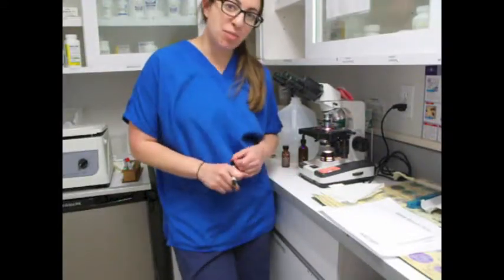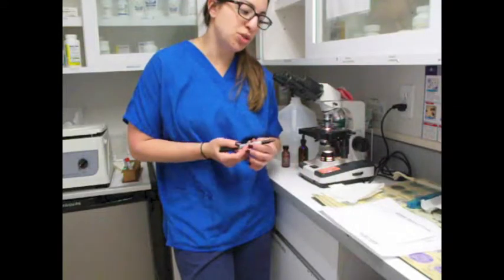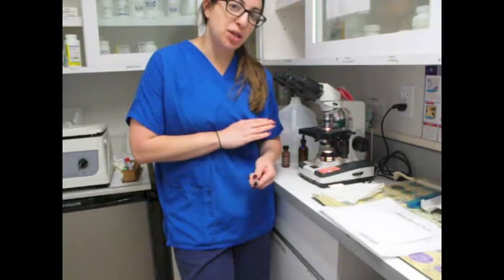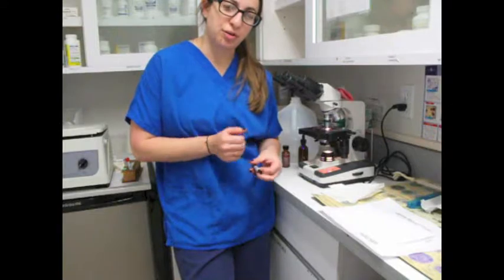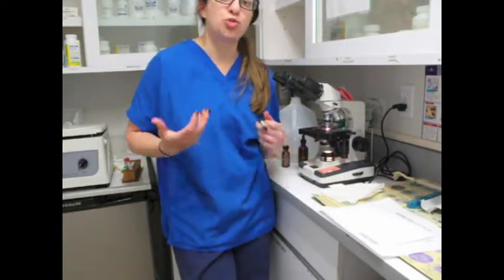So I'm going to begin performing my differential and counting my white blood cells. How you want to go about this is you want to read them on the oil immersion field, and you want to count 10 white blood cells per field until you reach 100.